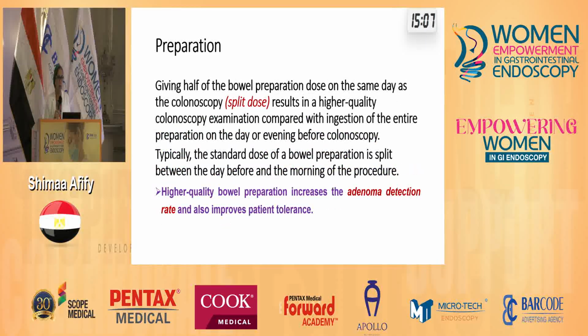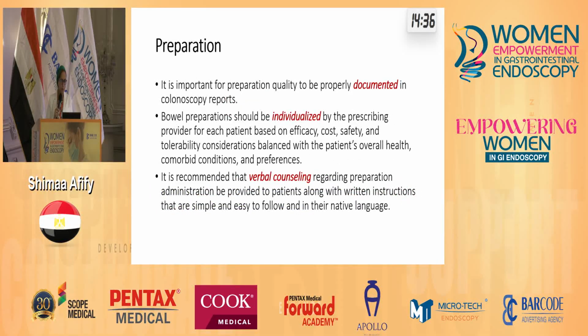Also, split dosing proved to be very effective in increasing the adenoma detection rate. Split dose is giving the bowel preparation in 2 split doses. If you are performing the colonoscopy, for example, tomorrow, then the patient will take 1 dose the night before and then 1 dose in the morning if you are doing it in the afternoon. And if you are doing it in the morning, he can split the dose the day before.